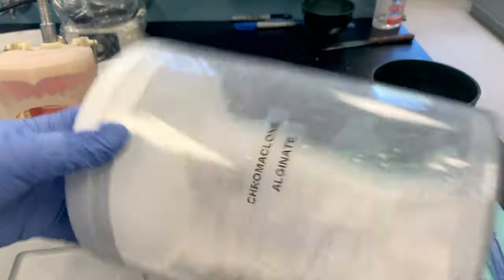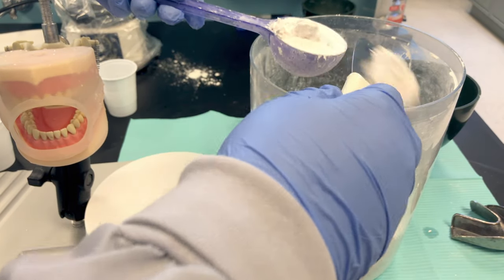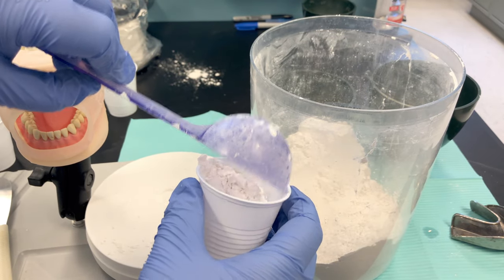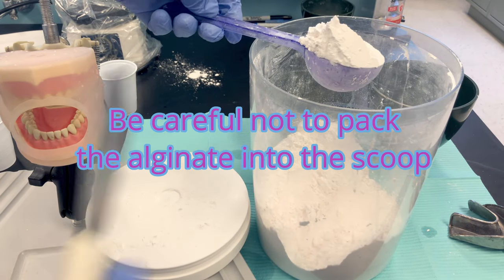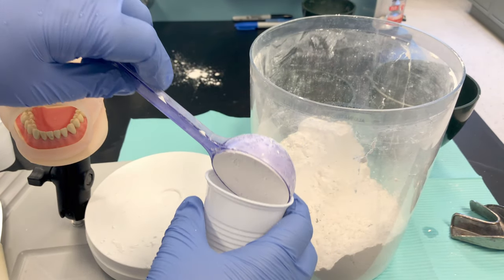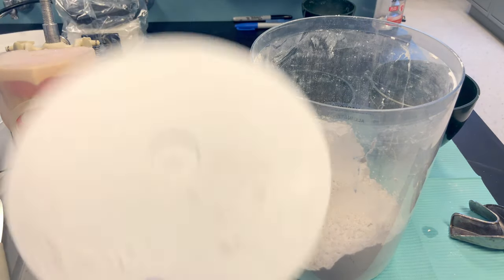Fluff your powder by rolling it around — that follows the manufacturer's instructions. Take a fluffy scoop, level it off, and transfer it into a cup until you're ready to mix. Take another scoop and level it off. Alginate is affected by humidity, so don't leave your powder sitting out exposed to air for too long. Always recap your canister of powder.